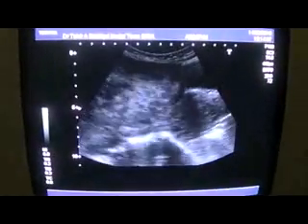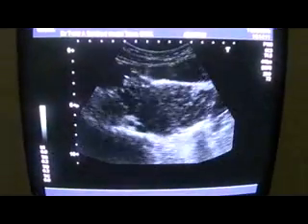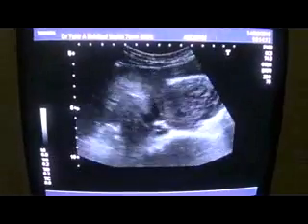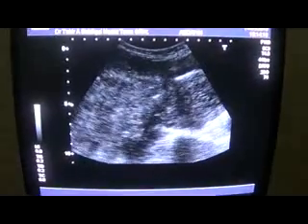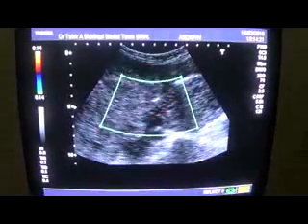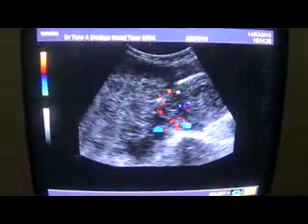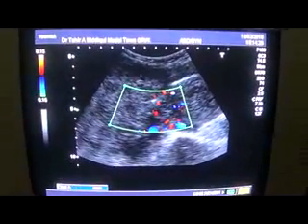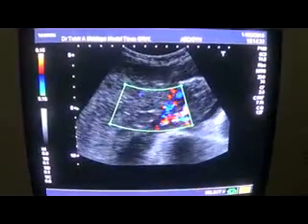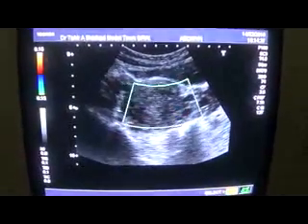Here we come to the uterus, and we cannot separate the mass from the uterus. Here it communicates with the uterus, clearly seen. You can see the vessels communicating, those of the uterus. This is the uterus and this is the mass. So the vessels are communicating.